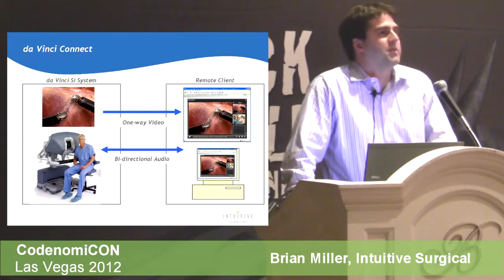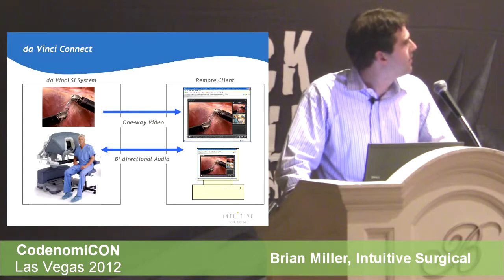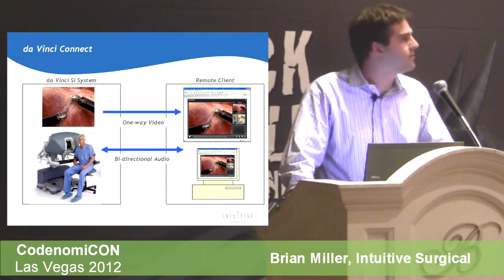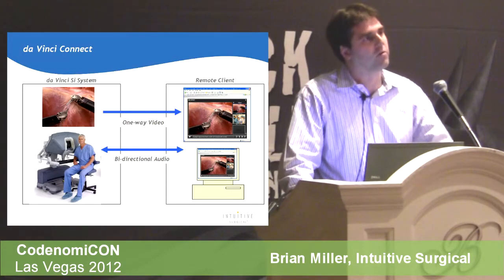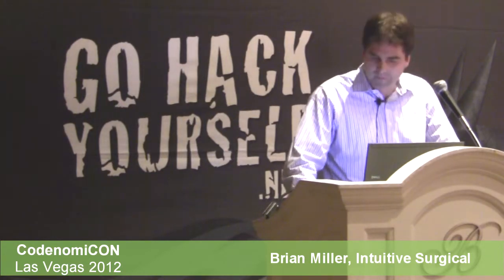A lot of these use some of the standard real-time audio transfer protocols, RTP, RTSP, to transfer that across the internet. These types of applications don't have the custom networks like the telesurgery did. We're trying to leverage the internet so that we can have a scalable solution, and something that we can build on top of what's already there. So some of the issues that we need to take into consideration are ones that are typical, whether it's our application or just a desktop telecollaboration type of tool.